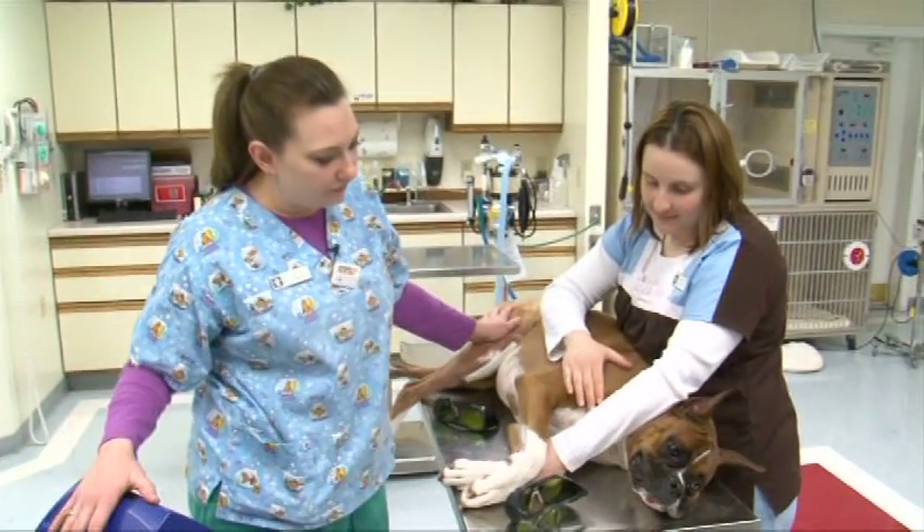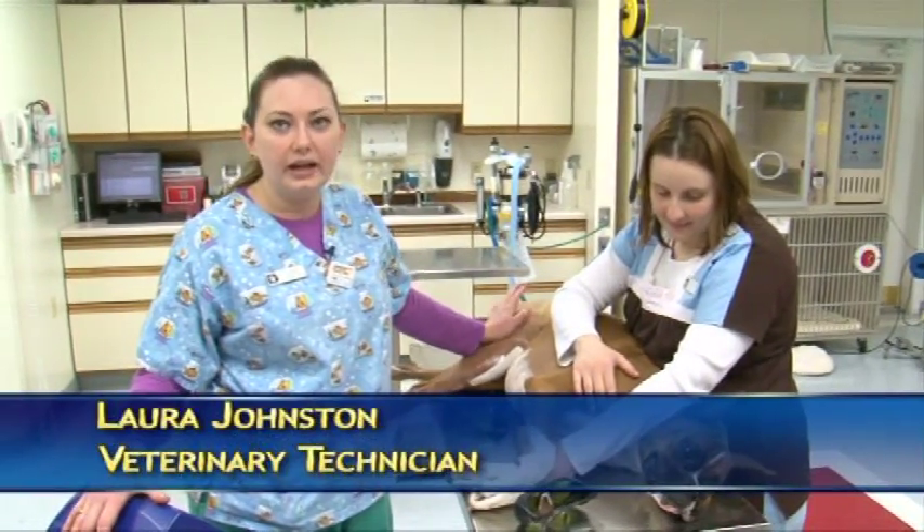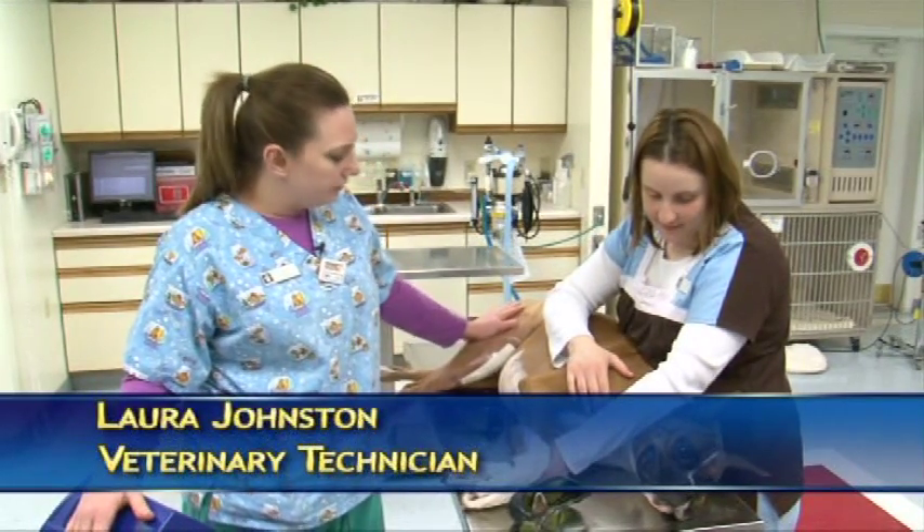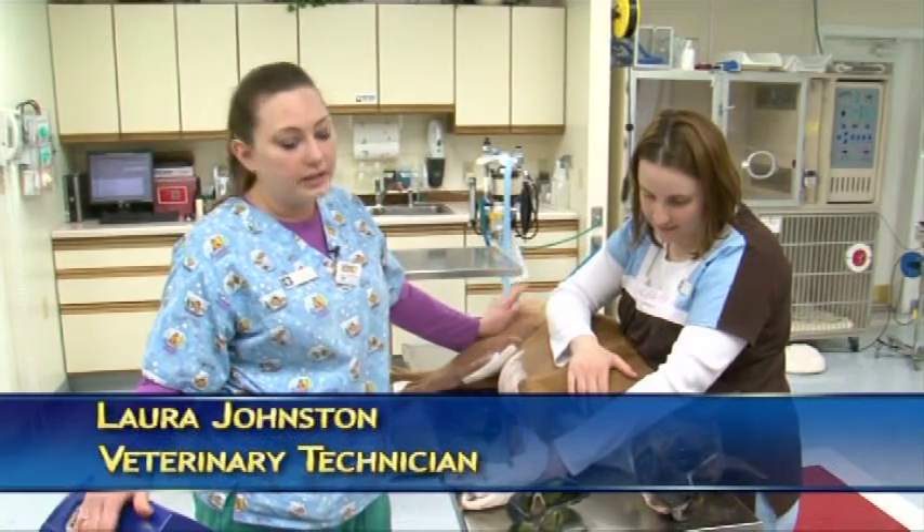This is Levi. He's two and a half years old. He came in yesterday and had his Cruciate repaired and we are going to be doing his first post-surgical laser treatment today.